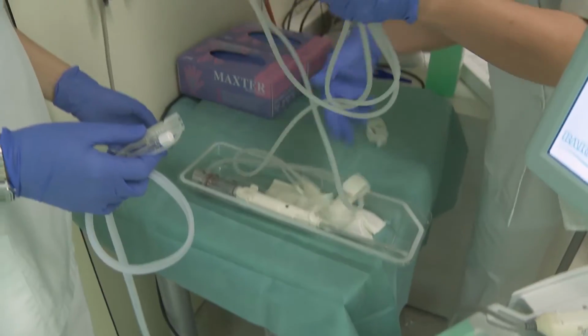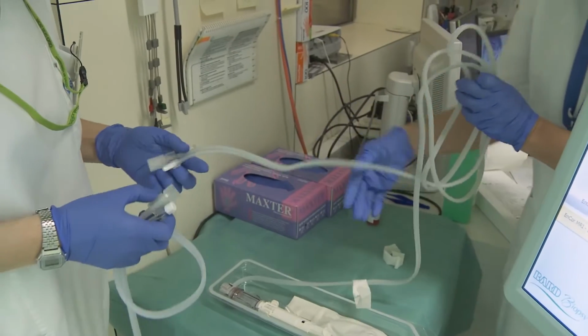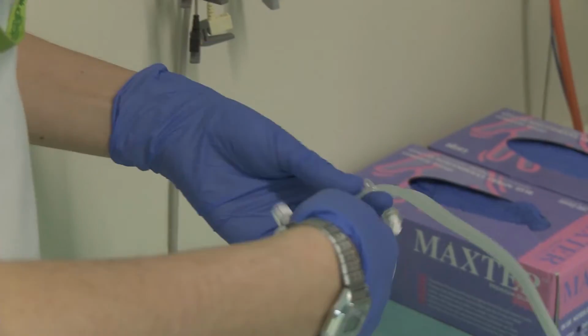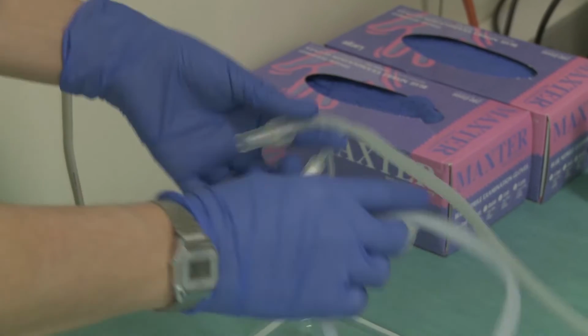The 10-gauge probe tubing is connected to the MRI tube extension, which allows for the console to be placed outside the magnet room.